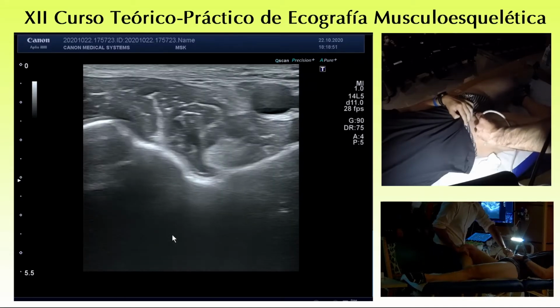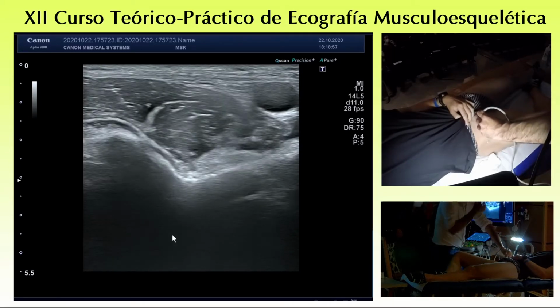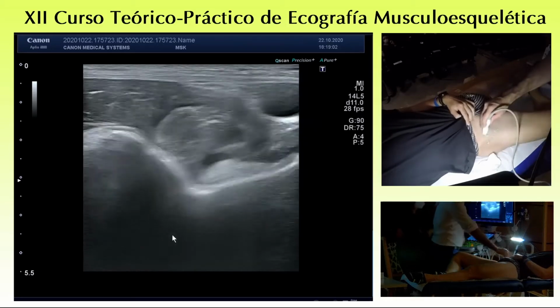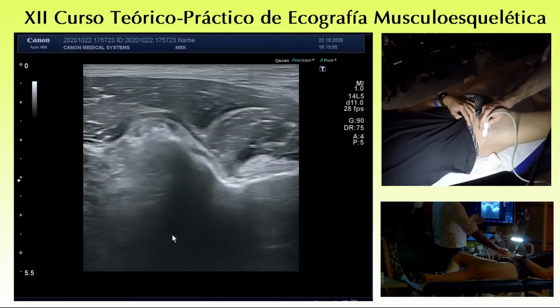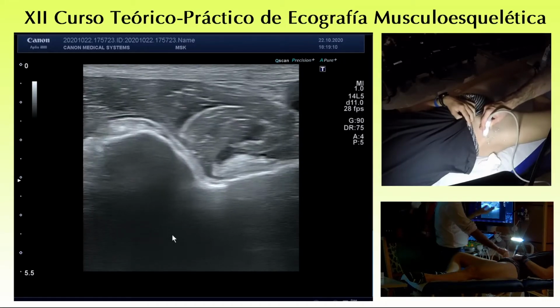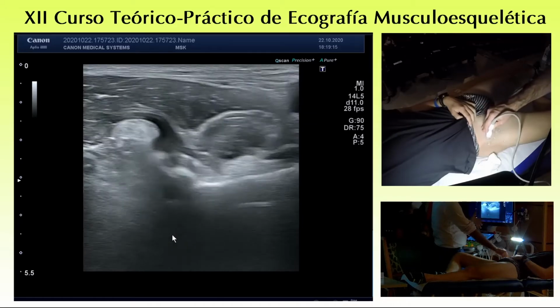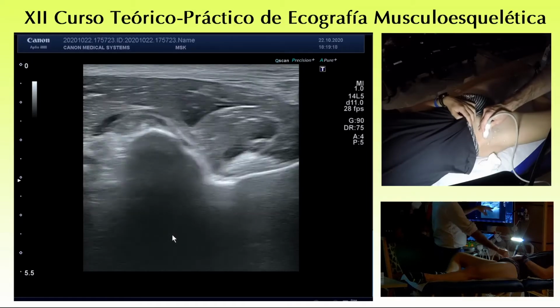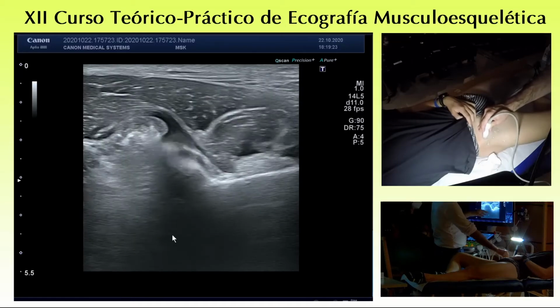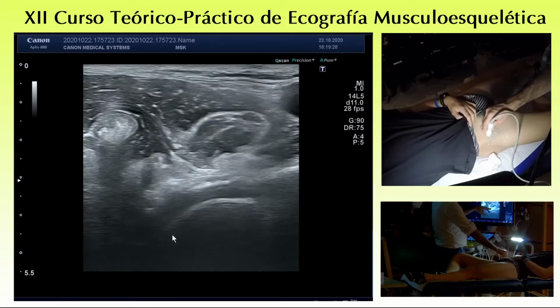In full extension, the leg. Okay, you see? There is a little snap, okay? Have you ever felt a snap in the hip? No. Well, it is quite frequent. It's just to demonstrate that the anterior snapping hip is not always symptomatic. The patient may not perceive it, or may perceive it but without pain. The important thing is to demonstrate with this maneuver the grade of the snapping, and moreover if there are any underlying causes, as you've seen before in the presentation, any ganglion cyst.